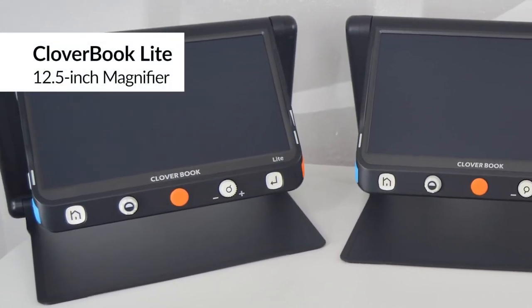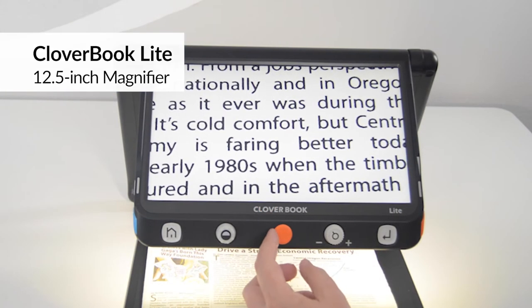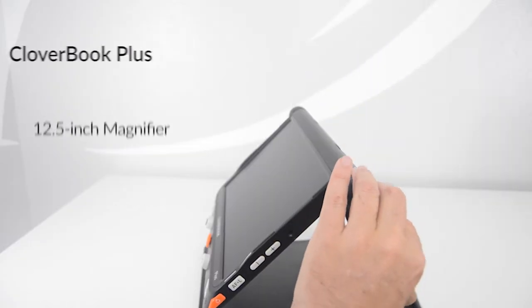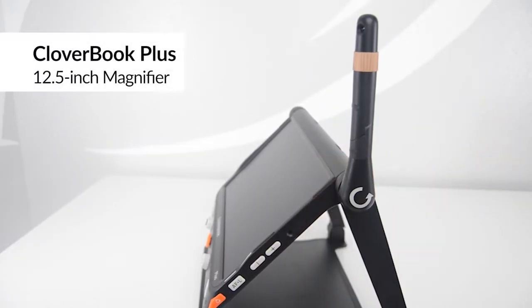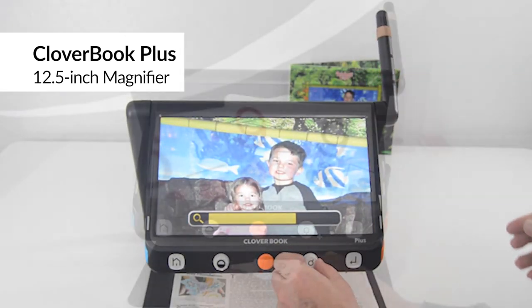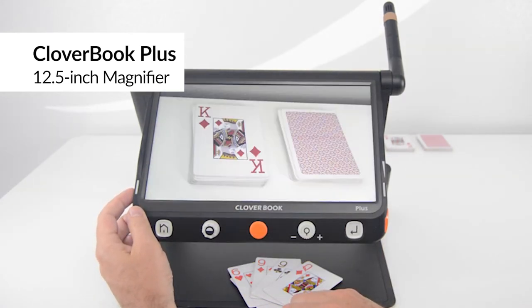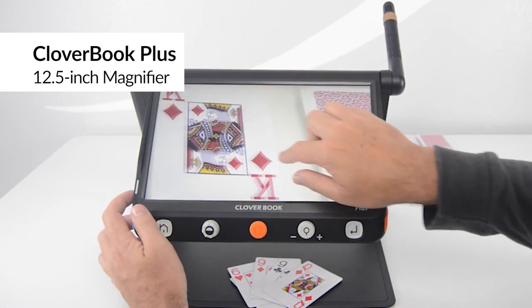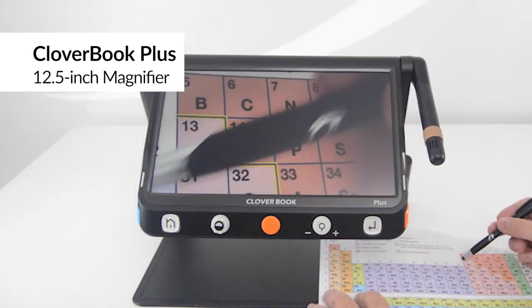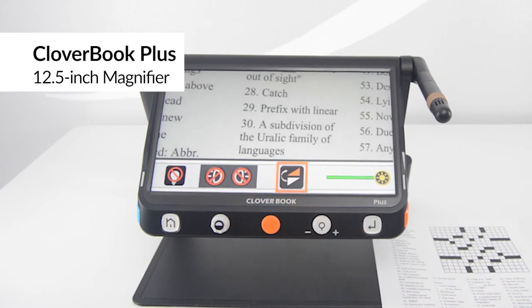The most affordable of the Cloverbook models is the Cloverbook Lite, which is great for extended reading and ideal for writing and hobbies. The Cloverbook Plus model adds a distance and self-camera — use it to view presentations or see signs at a distance. Cloverbook Plus is also perfect for playing cards and board games with no special adaptation necessary for the game, to see your hand and the table easily and privately. Cloverbook Plus is also great for schoolwork and hobbies and writing.